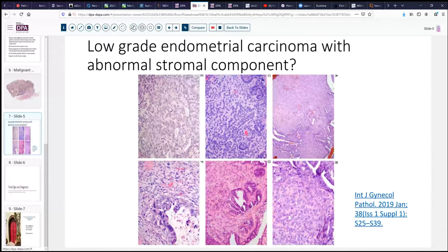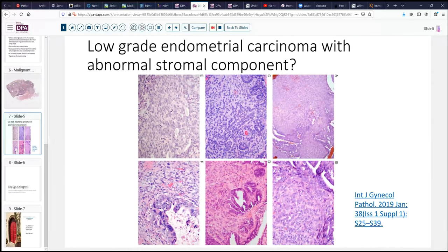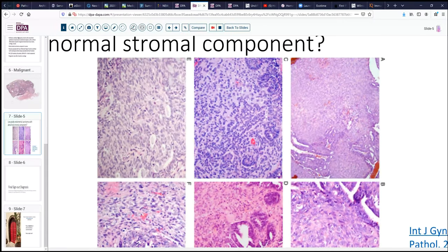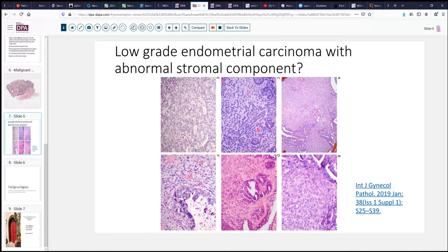One consideration is what do we do in the circumstance where we have a low-grade endometrial carcinoma and then some sort of abnormal stromal component. This is quite rare but not unheard of, and has been nicely described in a recent article from the International Journal of Gynecologic Pathology. These low-grade tumors are termed endometrial adenocarcinomas with spindle cell component, or endometrial carcinomas with corded components. These can look sort of like a mixed tumor with a chondroid type element. They should not be confused with a high-grade carcinoma with high-grade sarcomatous elements as described in carcinosarcoma or malignant mixed Müllerian tumor.